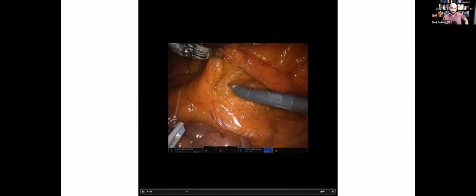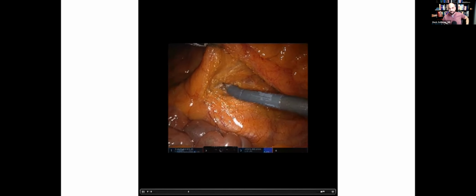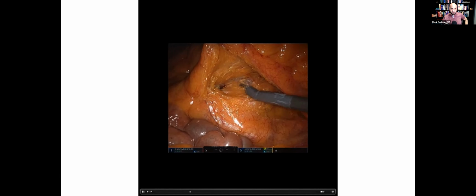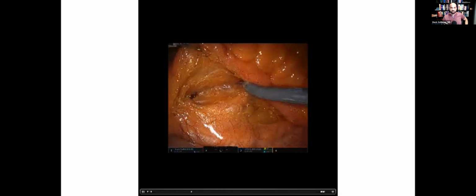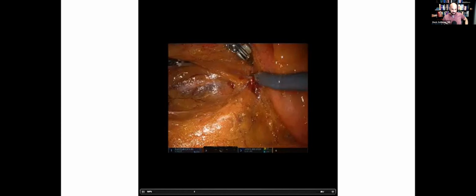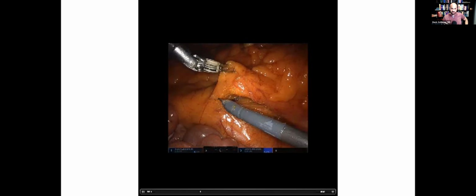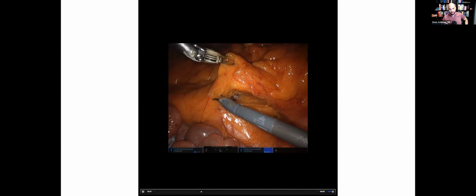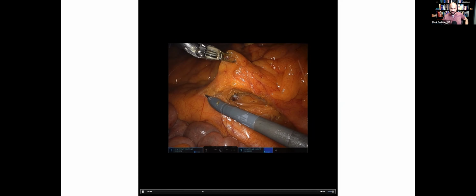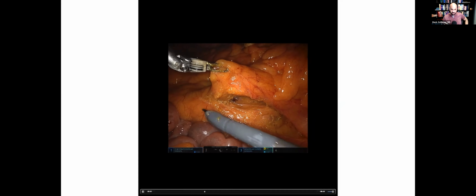Heading up here, north. Pulling up all this. Fast forward just a little bit. There's a ureter finally. And as we continue heading in this direction, let's see how this surgeon does with the IMA actual skeletonization. You can see it thumping kind of in the corner here, and you can imagine just dipping down right there to where the aorta is.